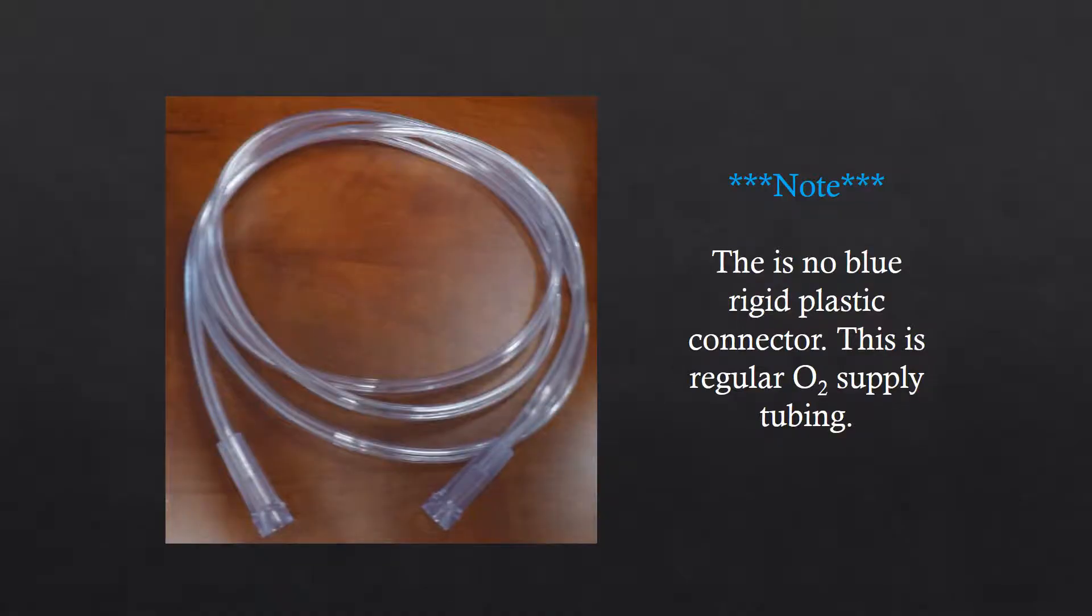To reiterate, the supply tubing is standard oxygen tubing. It does not have a particular end that needs to connect to the nebulizing chamber. Both ends are the flexible plastic. There is no blue hard plastic connector.